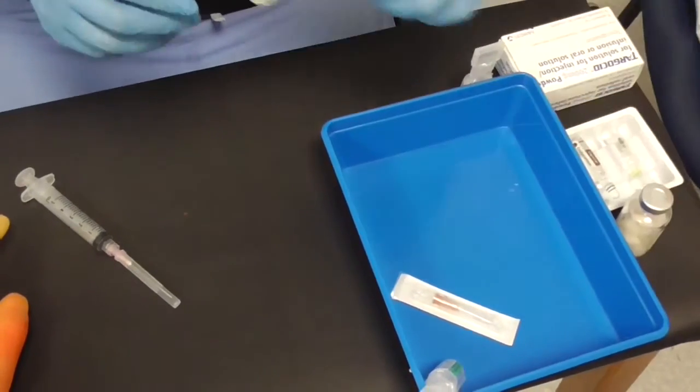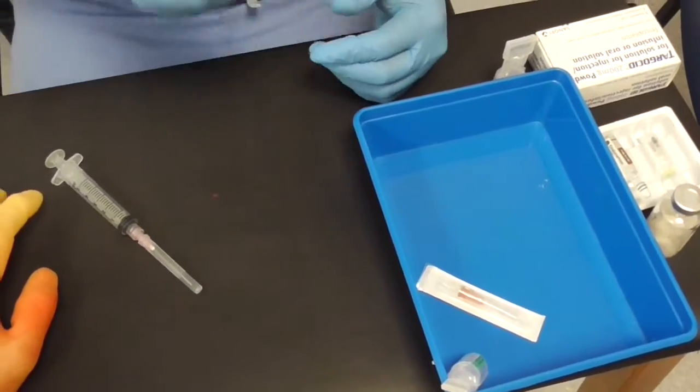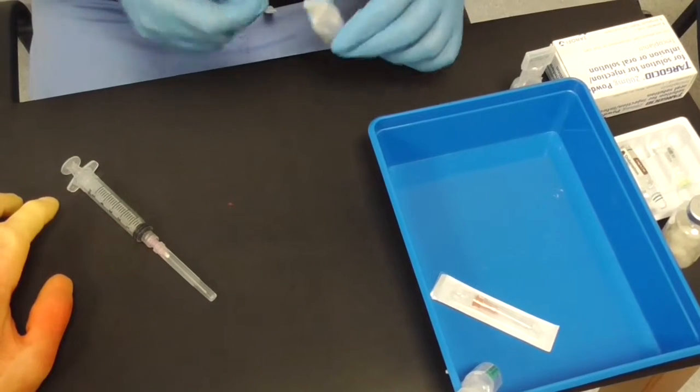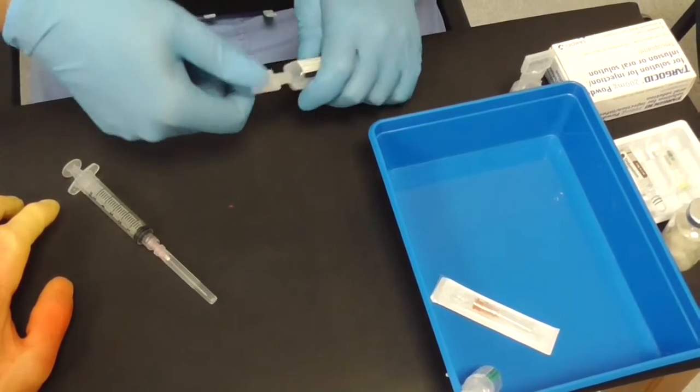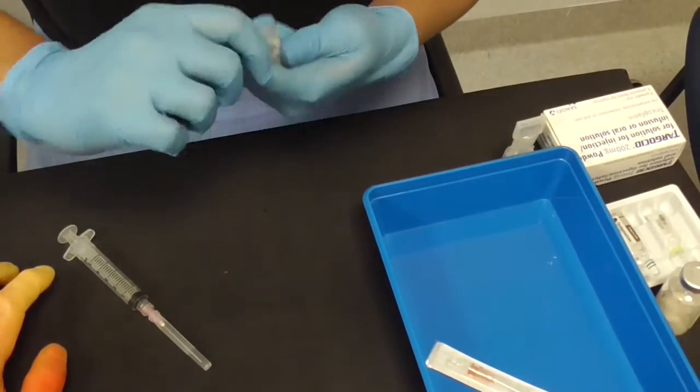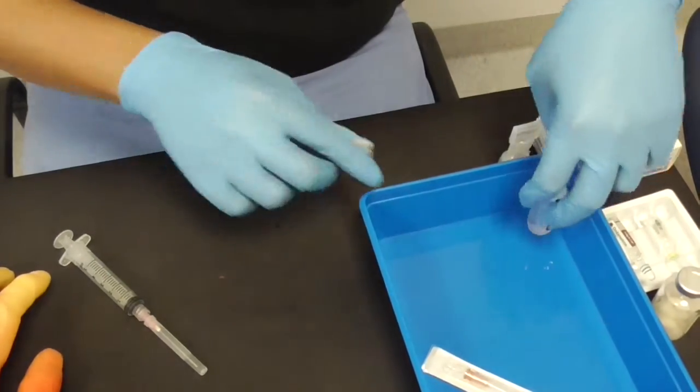Most things that you deliver intravenously will come in either a plastic bottle like this. The plastic bottles have a twist-off cap that you can twist off like that. Easy. And you've got a twist-off cap like that.